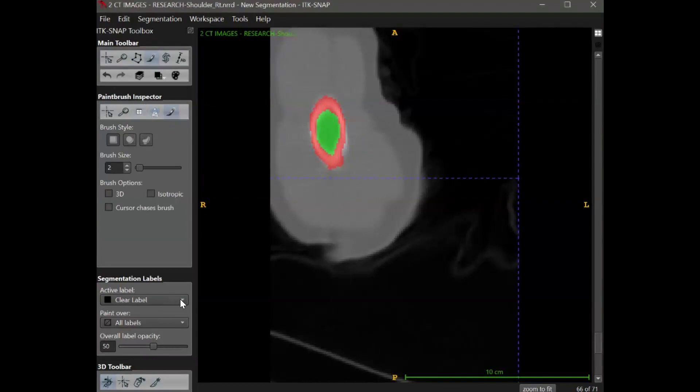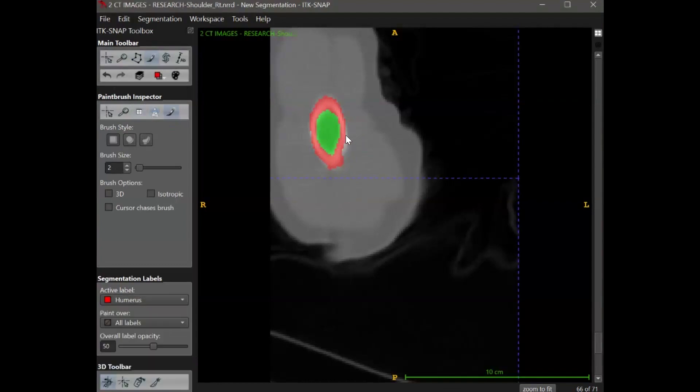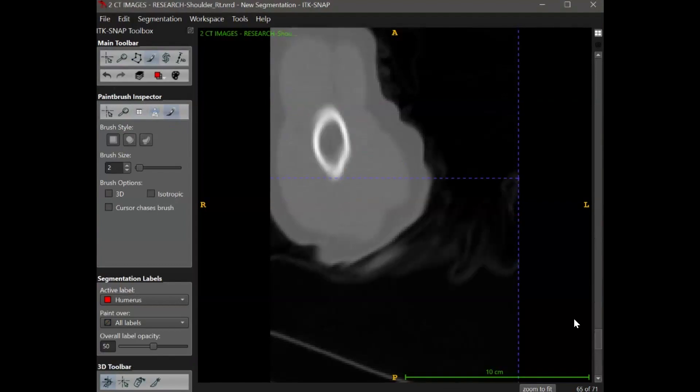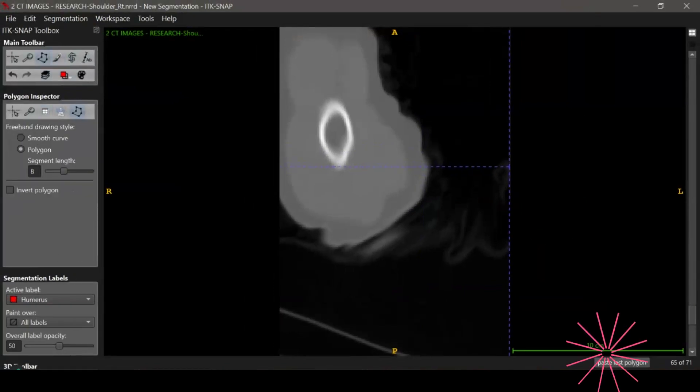With manual segmentation, you have to repeat this process for each individual slice of the image. There are some features in ITK-SNAP that make this a little bit more tolerable, like being able to copy the last polygon from the previous segment. But you can imagine that painting and selecting each of these slices can be pretty tedious.